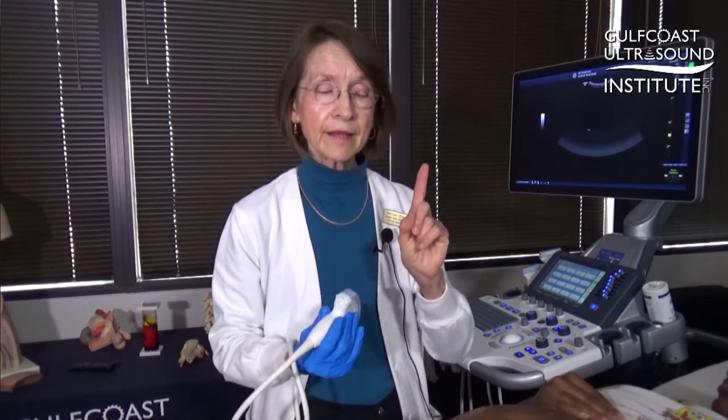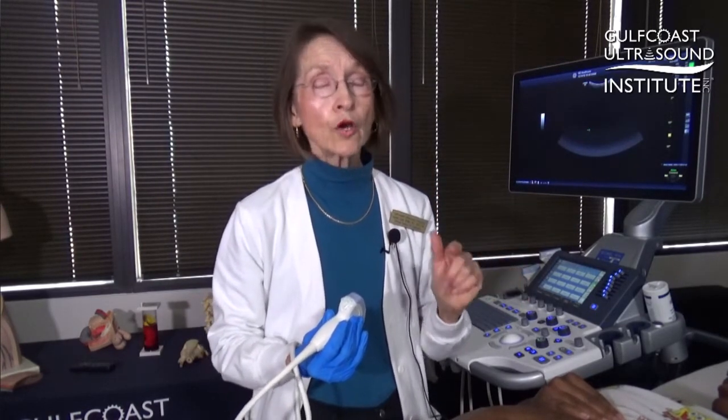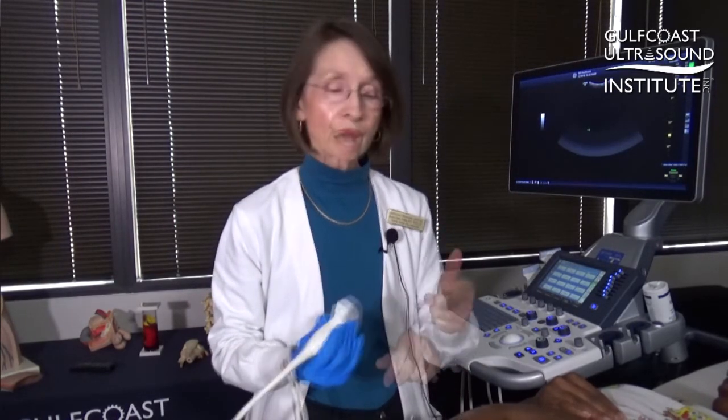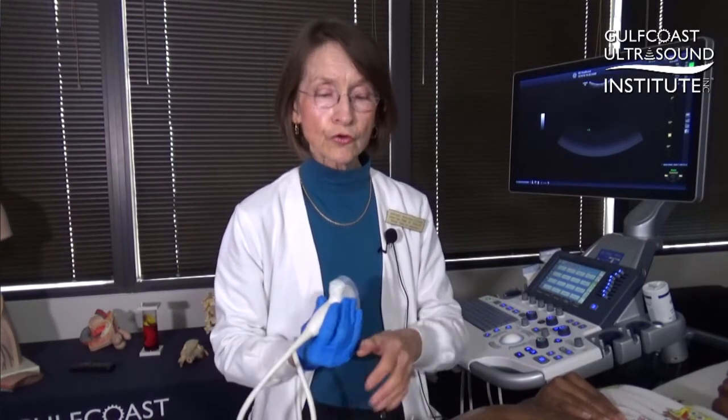We're only looking at one baby. It's in a cephalic presentation, longitudinal lie. When I go to do my measurements of femur, I know I'm going to be looking over on mom's right side. Looks like an active fetal heart rate there. Fluid looked pretty average — we can also tell if it's oligo or poly just in this one quick survey. You've got a lot of information, and when you go to do your measurements on your BPD, femur length, abdomen, you pretty much know now where to look to get those measurements done.